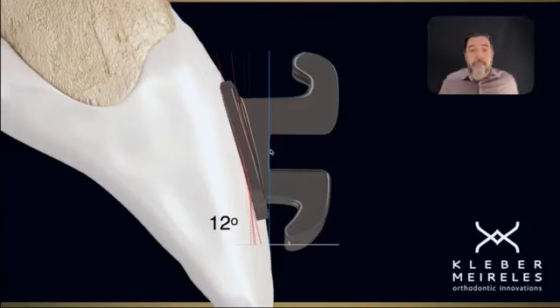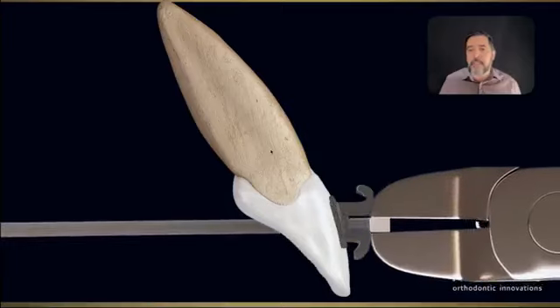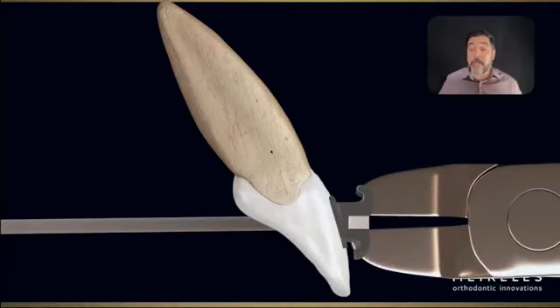We don't need, since the beginning of the treatment, to apply the torque. Even when we don't have a very good inclination of anterior teeth, we sometimes don't even need to apply the torque, because we have the play inside the slot. We have some differences in inclination of the anterior teeth, so sometimes we just accept the inclination embedded in the slot. And for the average case, this is good, because we can position the anterior teeth in relation to what we are planning. So I bought a class 3 prescription for this kind of patient.